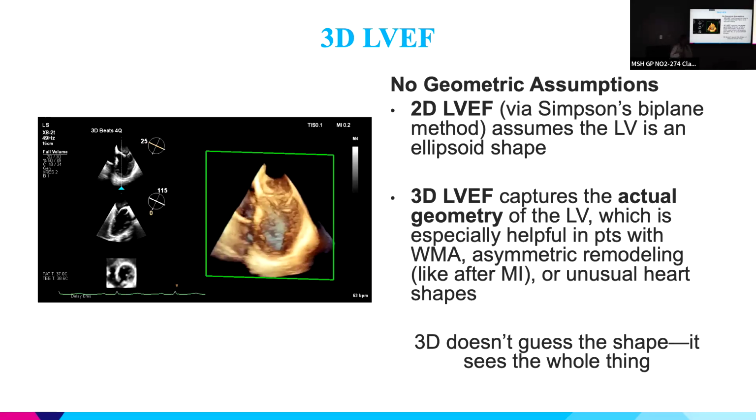We still have time, right? Okay, just quickly, 3D EF is something that you can use the 3D volume for. Now I don't know if you noticed, but my frame rate is 49. So this is a 4-beat acquisition. This is done in the OR with breath hold. Usually upstairs in the lab, you can get to the 20s pretty good with 2 beats. And that's all you really need. You don't need a 49 unless you want to give a talk about it. But this is really good high resolution.